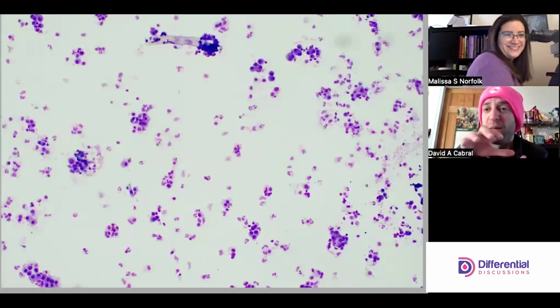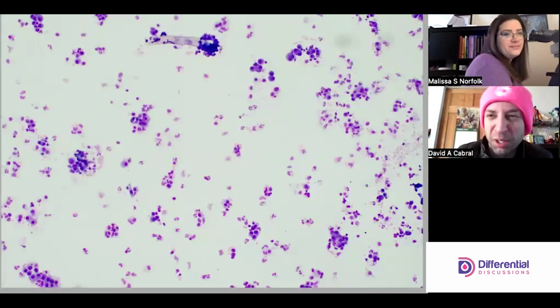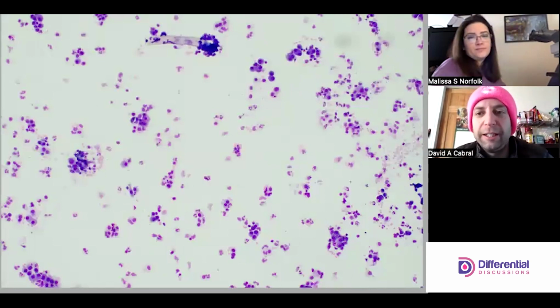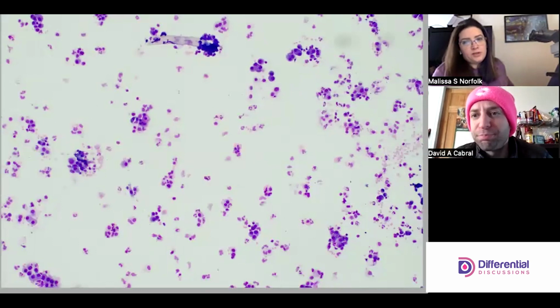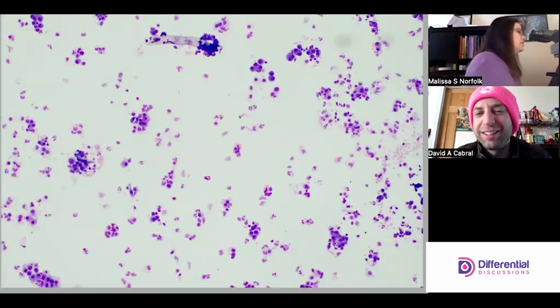Where it's darker and clumped to a point where it starts to get a height and a depth to it, you worry about tumors. I mean, it could just be a nice clump of cells. It could be some kind of fiber, junk, mucoid, stringy, a fibrin strand. It does depend.